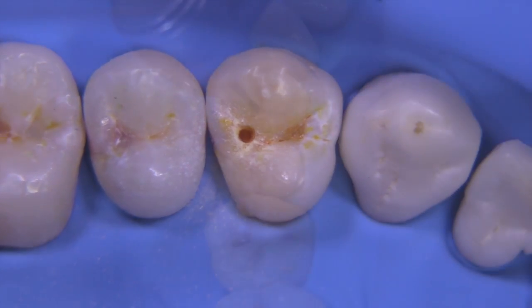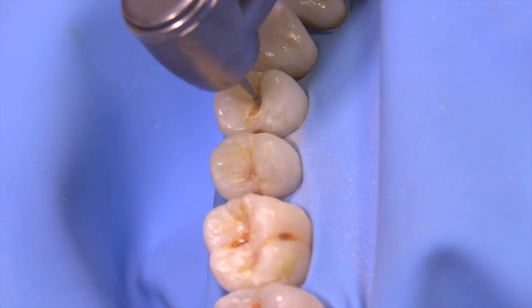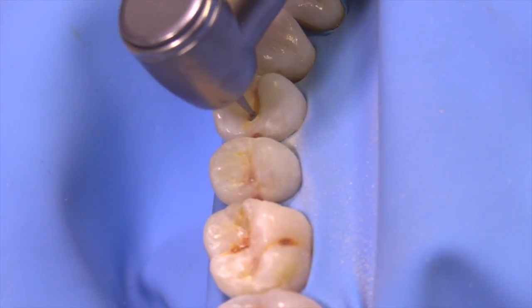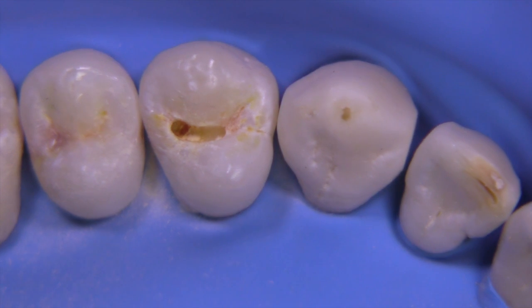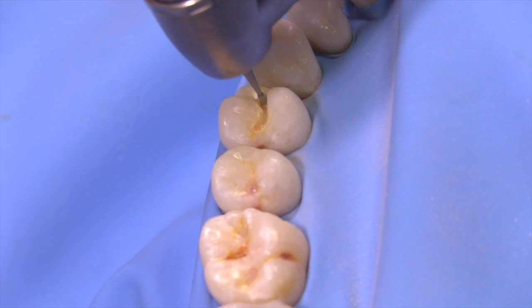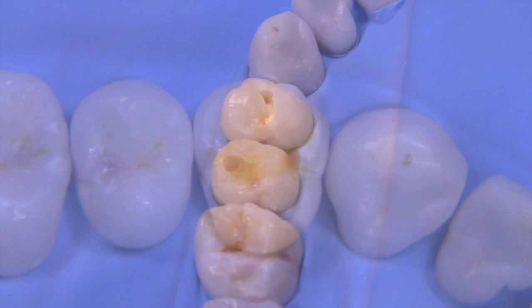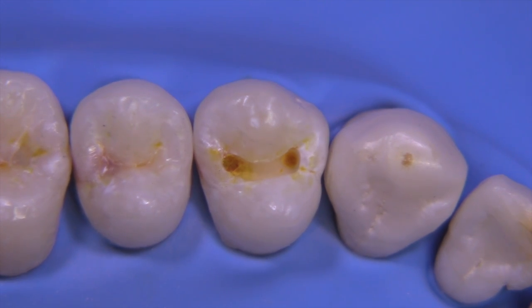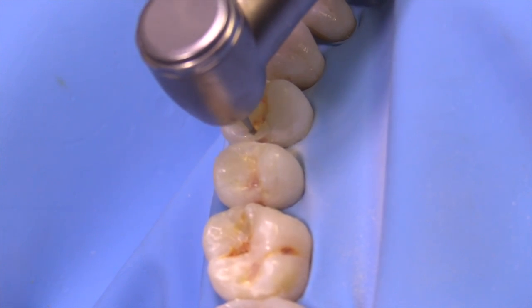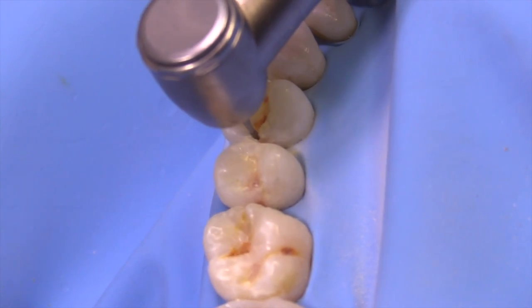We're going to start with the 330 burr and drop that to 1.5 millimeters. I like to do this near the box area because I'm not going to overextend into a marginal ridge. It's really important to keep the burr perpendicular to the occlusal surface at all times. We're now going to extend into the mesial side to create the dovetail, trying to keep the dovetail parallel to the proximal surface. Then we extend out towards the proximal contact on the distal, aiming towards the contact and not trying to create the box at this time.